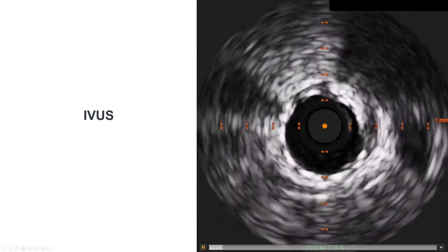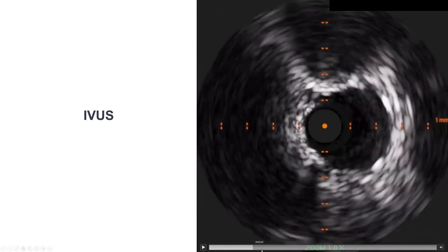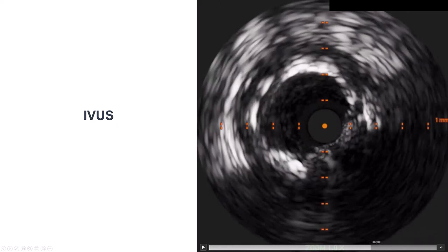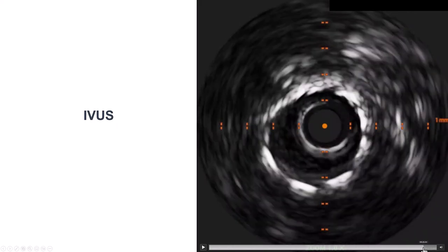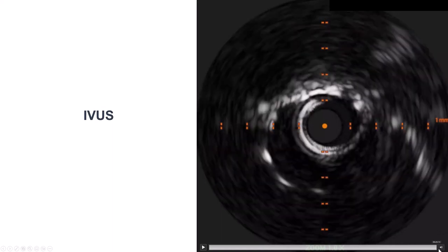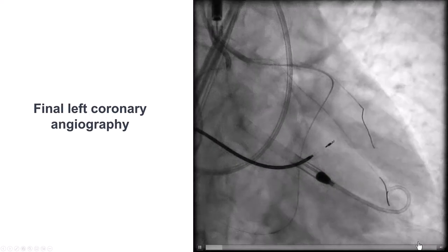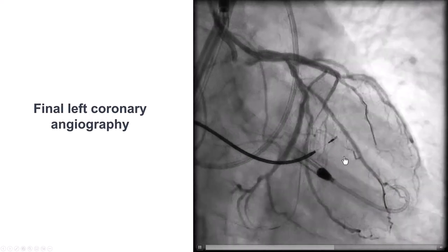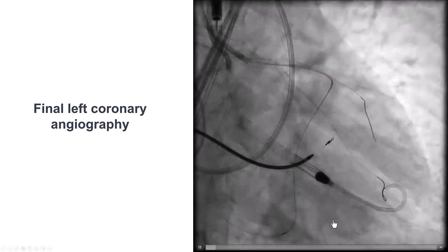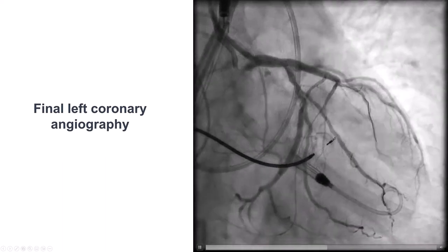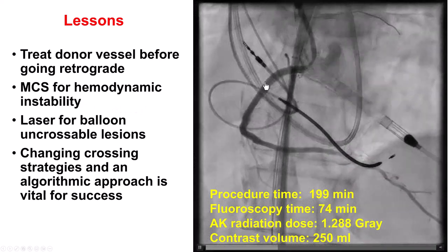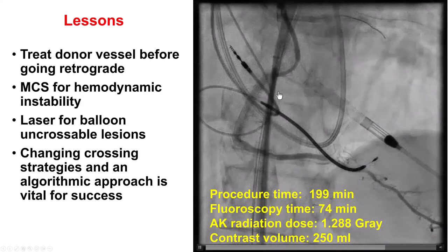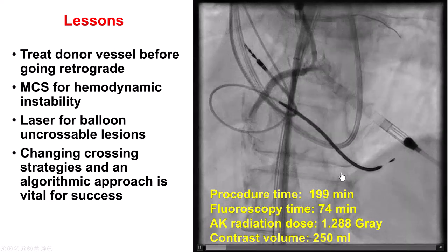We stented all the way to the proximal right coronary artery and performed intravascular ultrasound. The vessel and the stent appear well expanded, and the stent extends nearly all the way into the aorta. The final image on the left shows no injury to the left system and a good result of the left main stenting. The final image of the right coronary artery shows good antegrade flow into the RCA and the PDA.